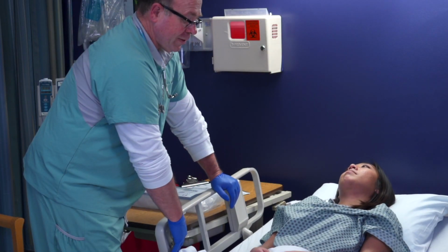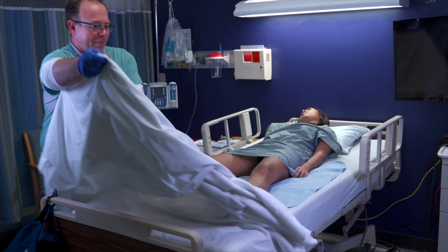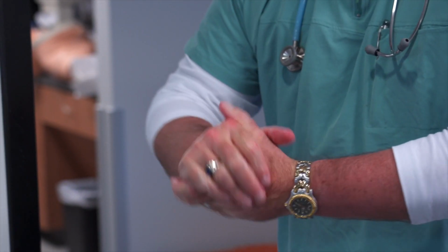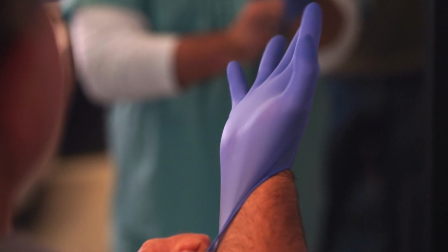Lower the head of the patient's bed to a flat position. Have the patient bend their knees with their legs spread and hips externally rotated. Stand at the side of the bed in which your dominant hand is closest to the foot of the bed. Remove the patient's bed covers, pajama bottoms, or underwear. Remove non-sterile gloves and perform hand hygiene. Don a new pair of non-sterile exam gloves.